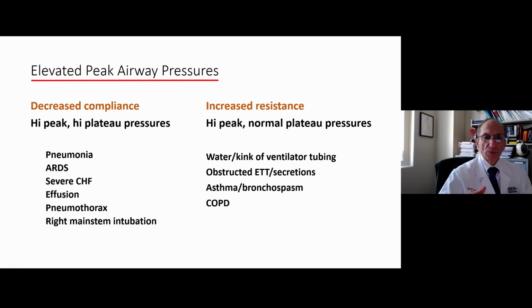That's one of the classic ones where the lung itself is getting very stiff. It takes greater pressure to inflate it, but it would not change the difference between peak and plateau pressures. Normally, that difference is only about 5 to 10 centimeters of water. So in somebody who's getting increasingly stiff lungs, the peak and plateau pressures would rise pretty much proportionately.